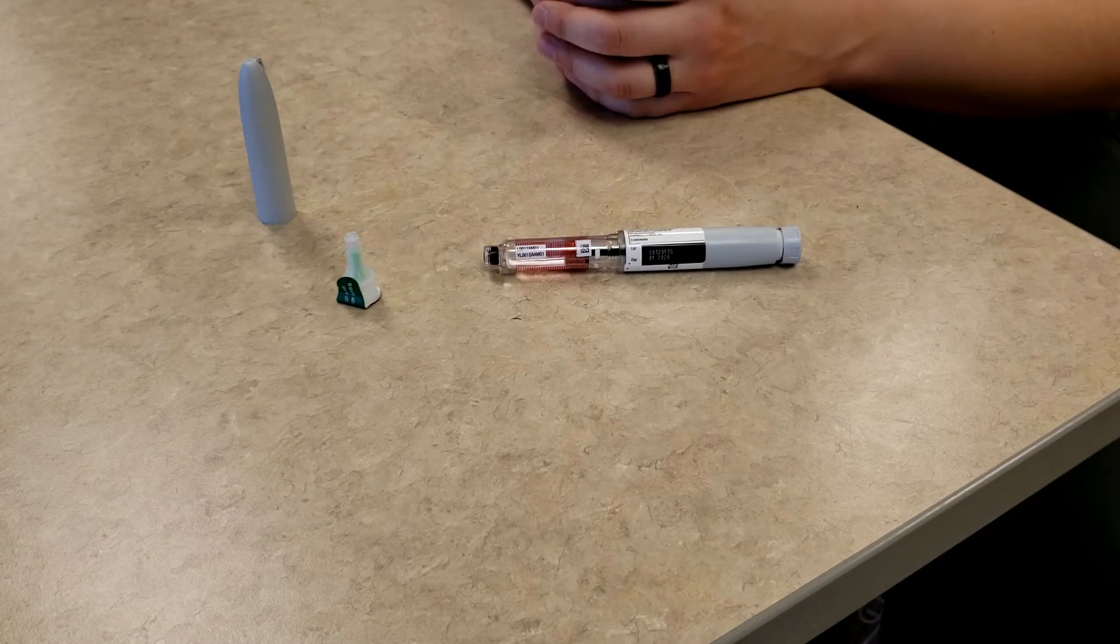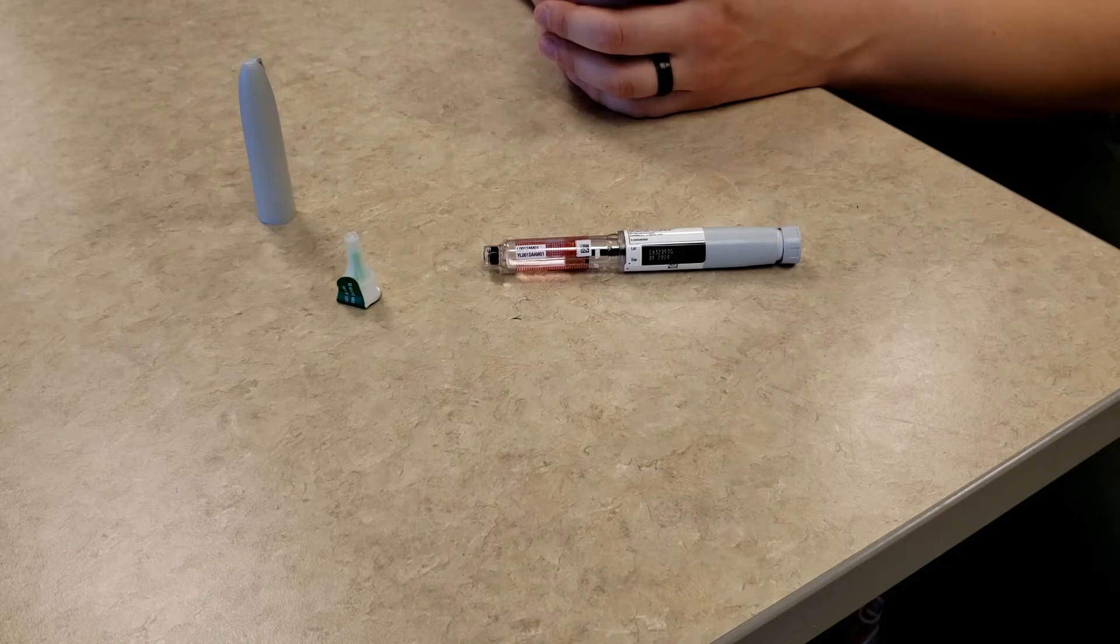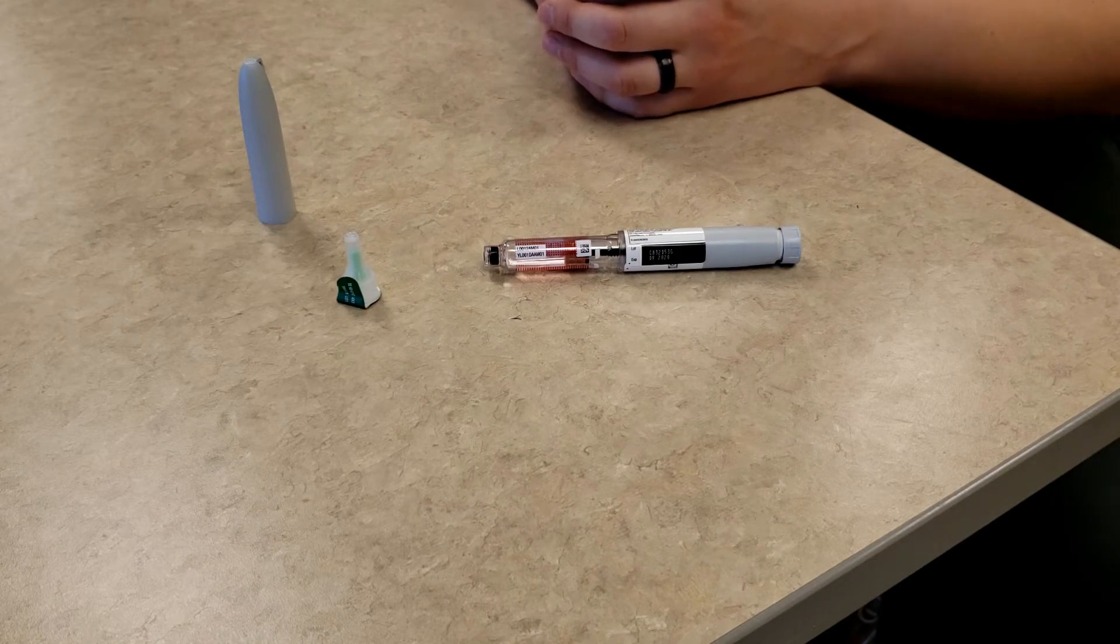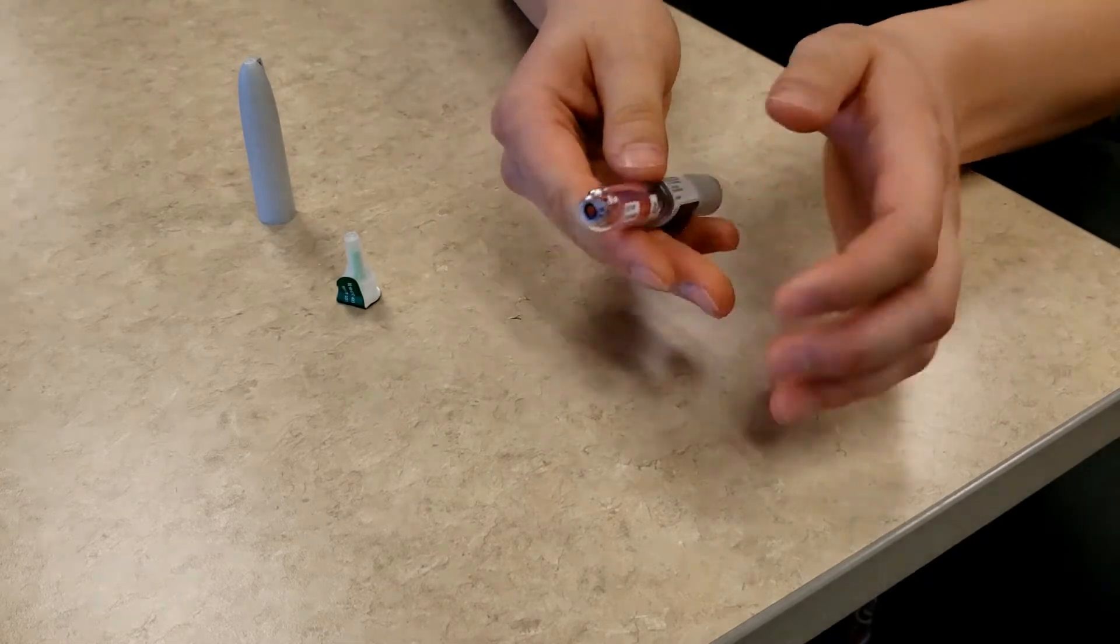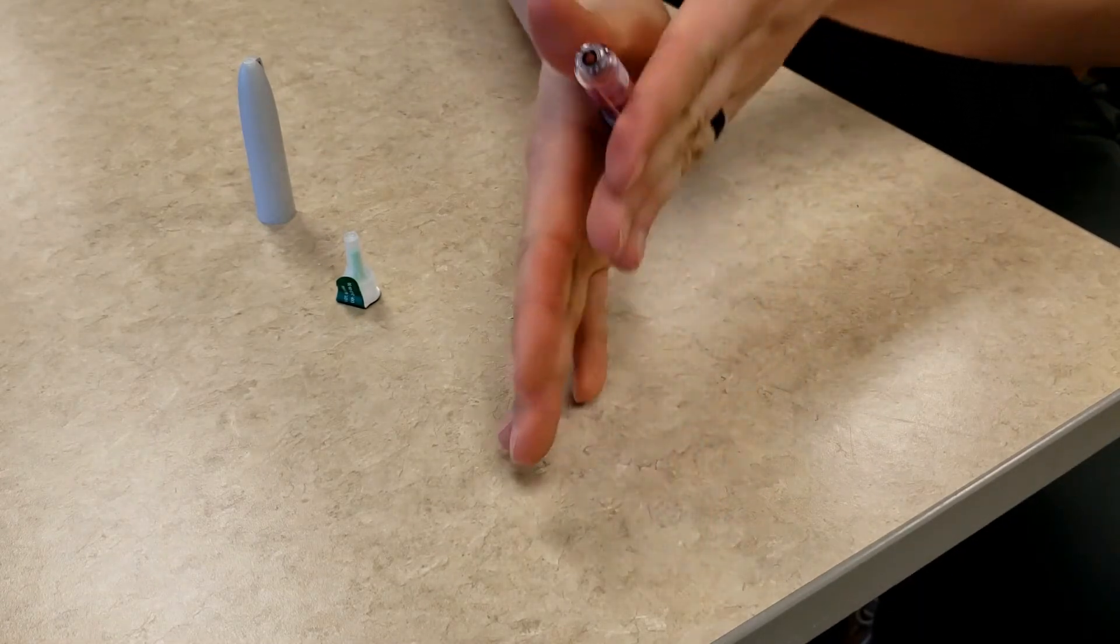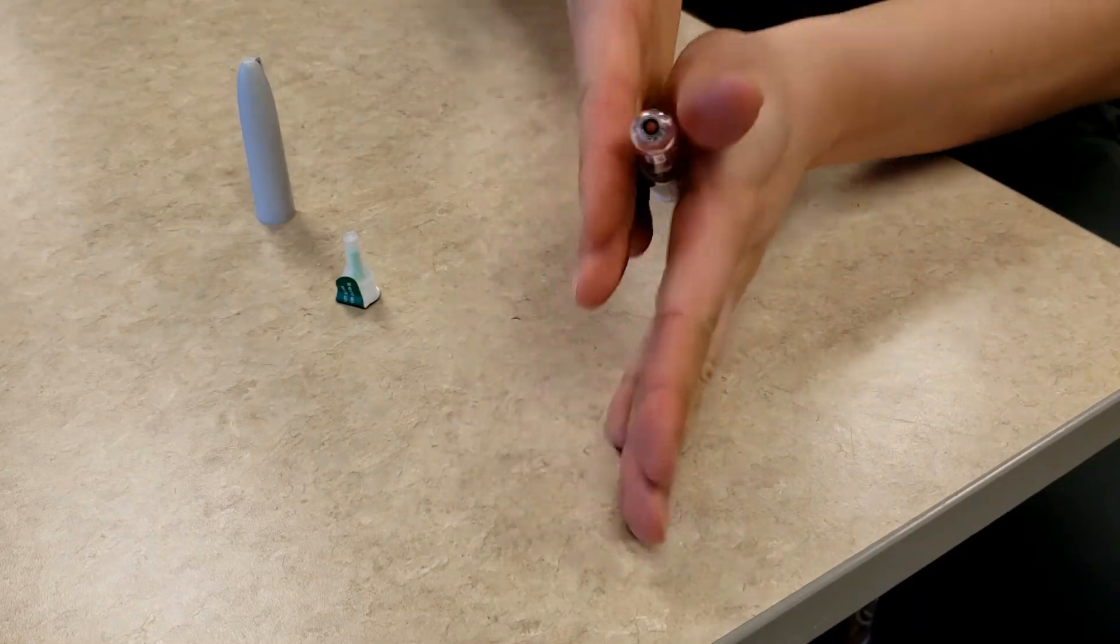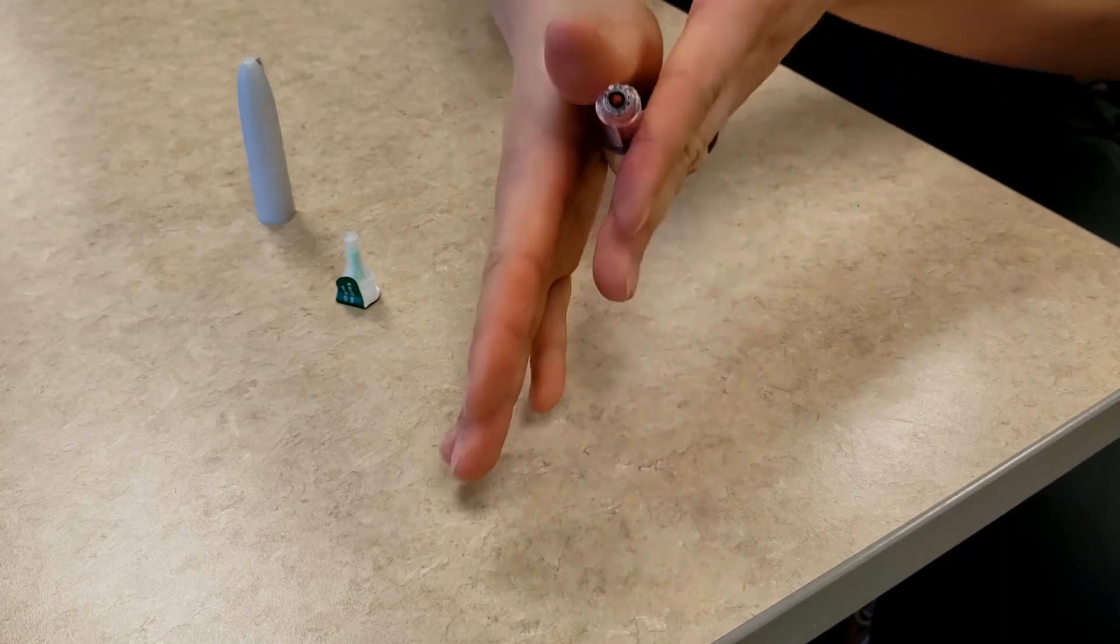If the type of insulin that you are using is NPH or premixed insulin, gently roll or rotate the insulin pen about 10 times. This is to ensure that the medication is evenly dispersed.